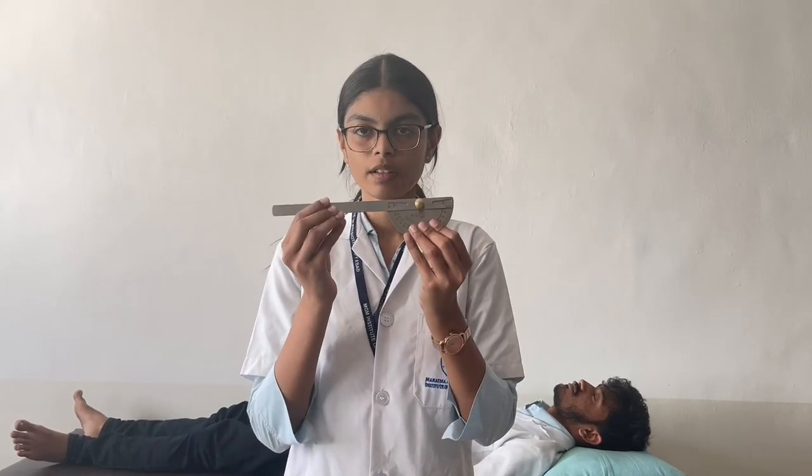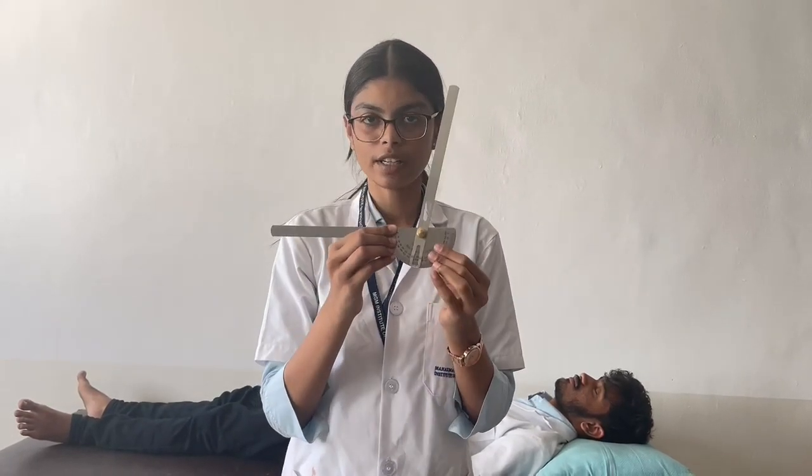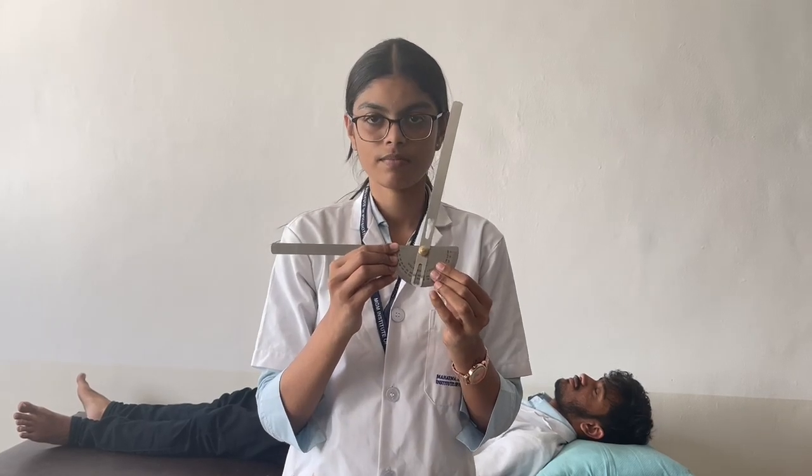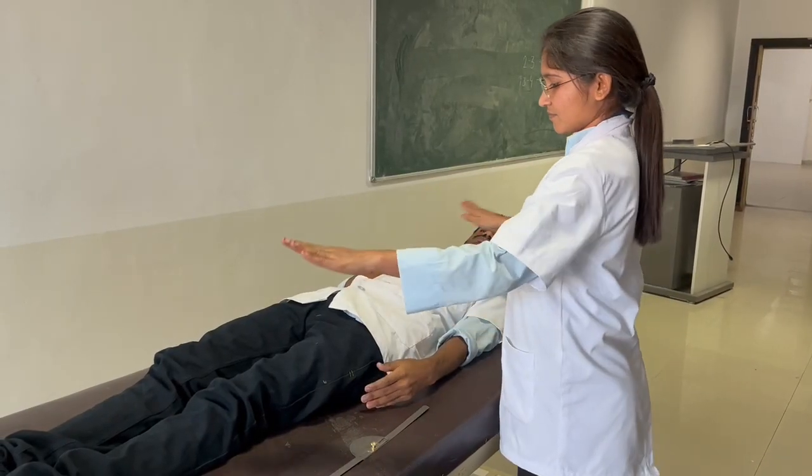Hello everyone. From 11 to 20, we are going to measure the range of motion of elbow joints — that is flexion, extension, pronation, and supination — using the instrument goniometer. The goniometer has a movable arm, a stable arm, and a fulcrum. Let's proceed. First, we will be performing elbow flexion, for which the subject will lie in supine position.